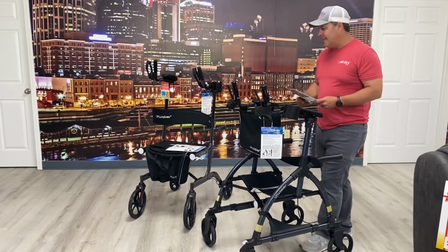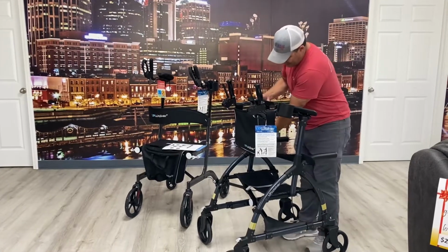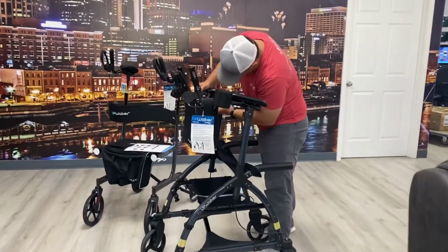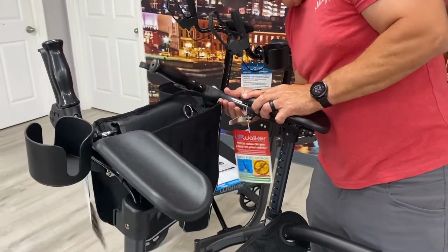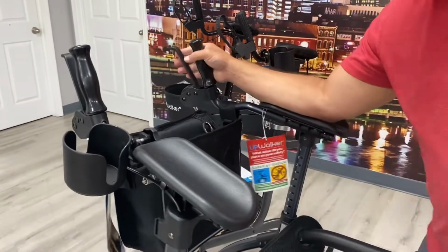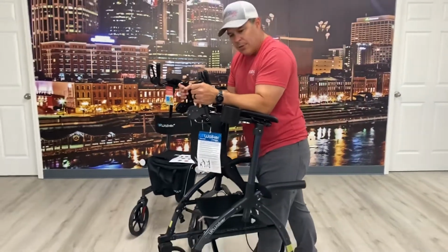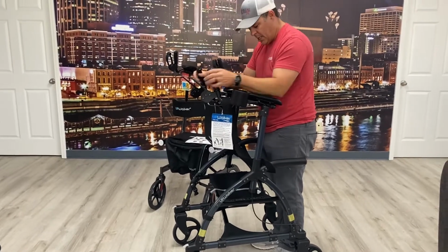But some of the nice things that I like about this is you have the ability, again, to make this minor adjustment, get your arms right. You also have the ability to move this in and out a little bit. You have a little bit of play where you can slide the armrest out some and adjust it where it needs to be, so you'll be comfortable and you'll have the handles at a comfort level. You can squeeze the wheel locks here. You can also push them and lock them in place so when you go to sit down.